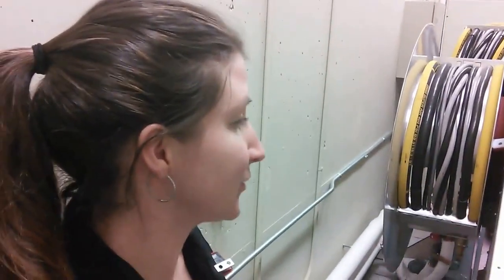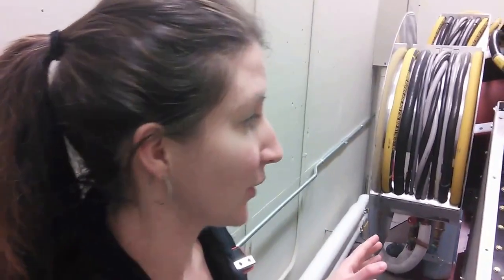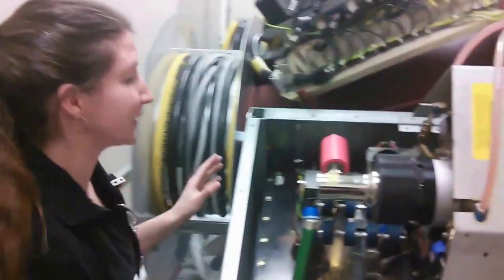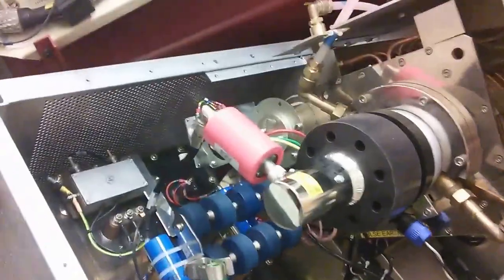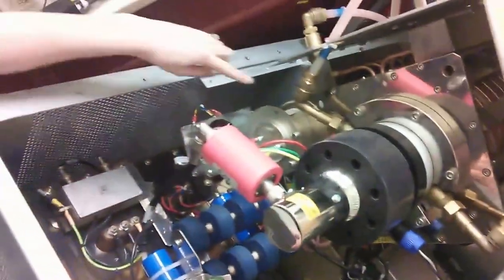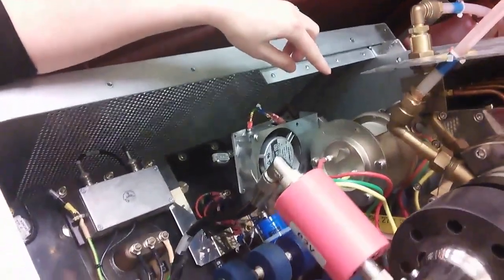So today we're doing a PM on the device. We've had some arcing in the cage. So we are planning to replace the Thyratron, which is here — this is our high voltage assembly here. And so this is the magnetron. Here we have the Thyratron, which is the part that we are going to change out, which is essentially a high voltage switch.